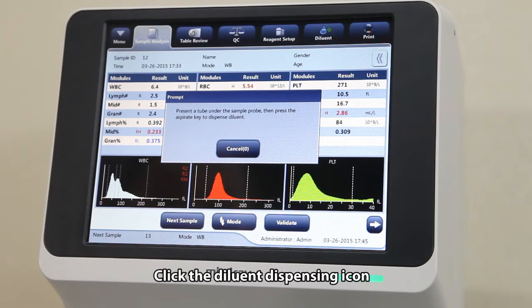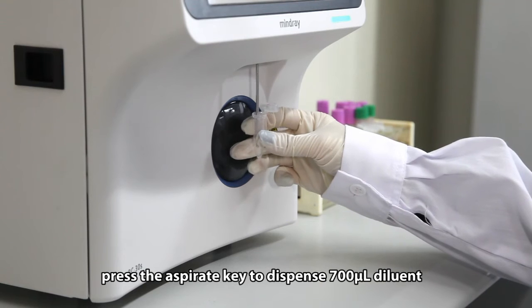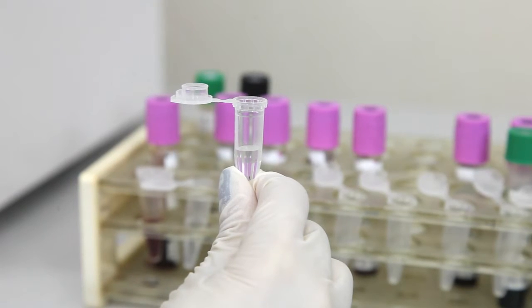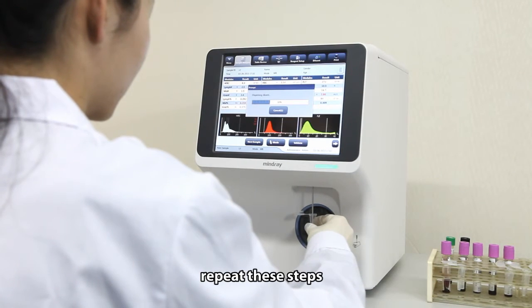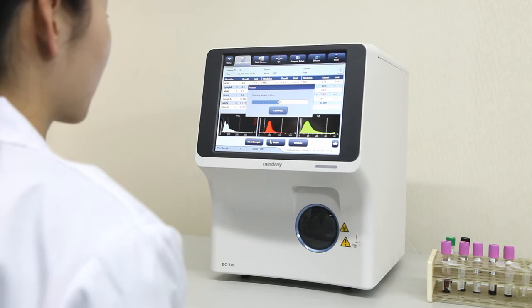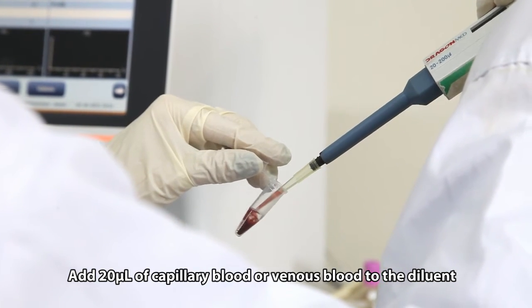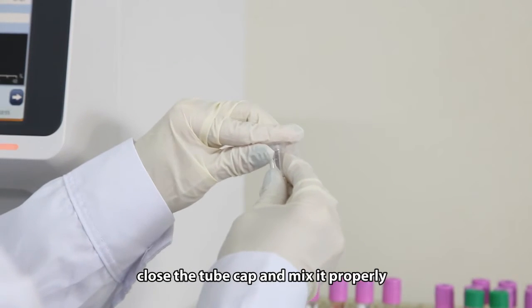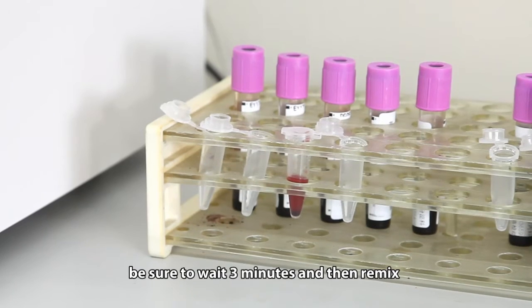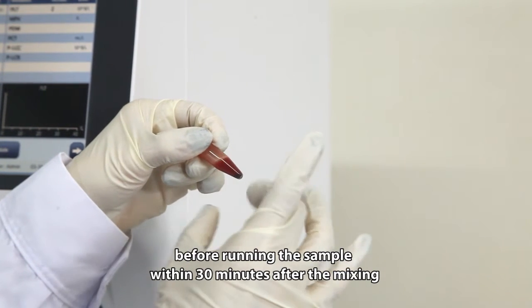Click the dilute dispension icon, then present a clean tube to the sample probe. Press the aspirate key to dispense 700 microliters diluent. To continue with diluent dispensing, repeat these steps. Click cancel after preparing all the diluents. Add 20 microliters of capillary blood or venous blood to the diluent. Close the tube cap and mix it properly. After mixing the capillary sample with the diluent, be sure to wait 3 minutes and remix it before running the pre-diluted sample within 30 minutes after mixing.